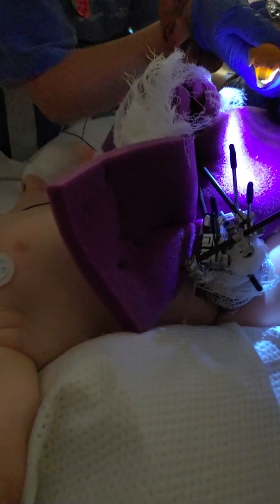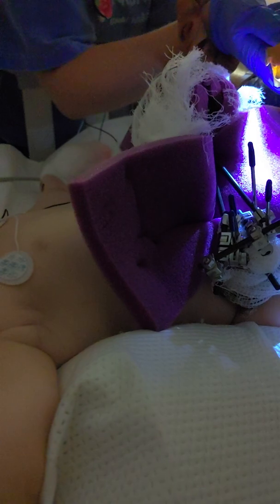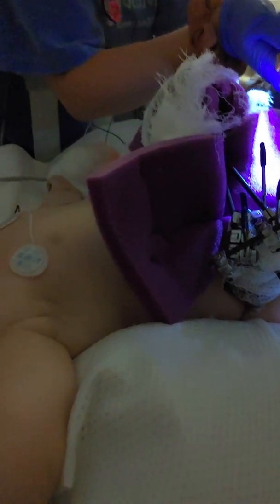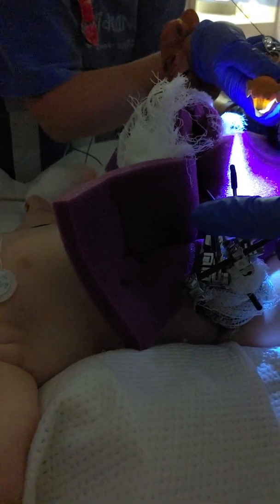So all of these, all these four of those? These two are in the lower part of the bone. Okay, so below where I made the cut. So these are the most important in terms of closing down that area of his hip and his pelvis that was wider. These two honestly help mostly with stability, because this piece of bone here is so small. That's the part that actually comes up over the pubic area, right? Yeah, exactly. It's a really tiny place to put the hardware into.